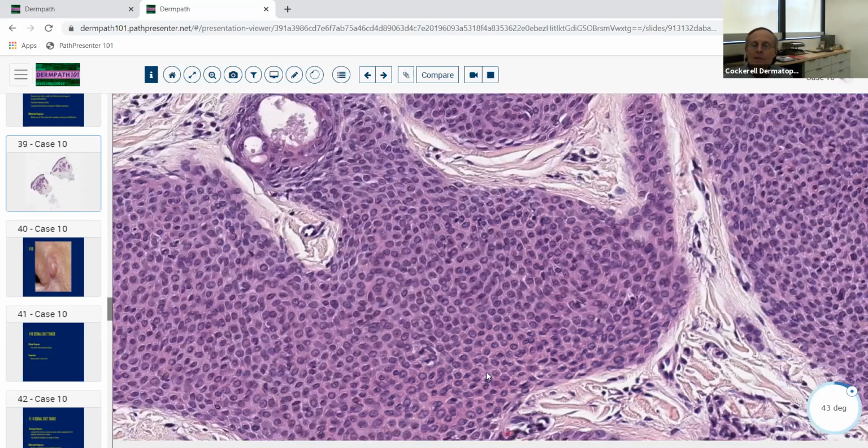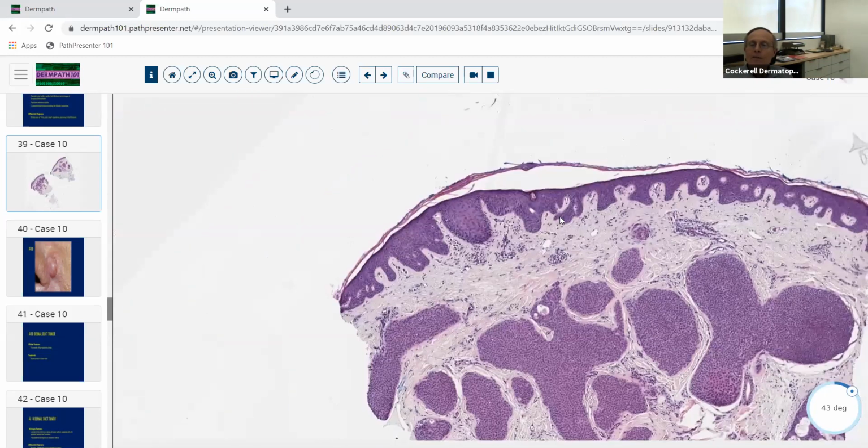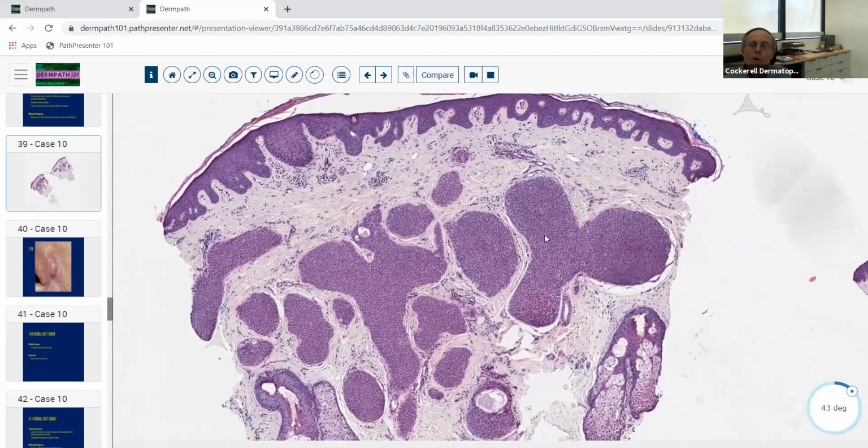So we go back to lower magnification once again. If you think of this as a poroid lesion, there are four lesions that have poroid differentiation to them. So the most common one, or the classic prototypical one, when we use the name in there, is going to be what? What's going to give you the most common? Yeah, eccrine poroma. Okay, so think of that as just this big warty lesion that's connected to the epidermis. And then we get poroid hydradenoma. We get hidroacanthoma simplex, which is almost kind of like a poroma in situ, where you just get these same kind of cells filling the epidermis over a broad front.